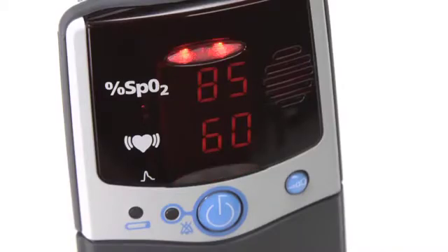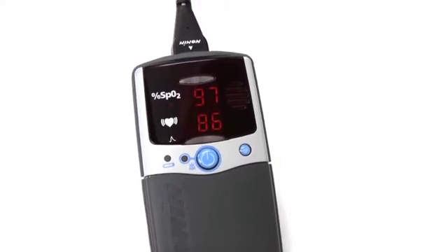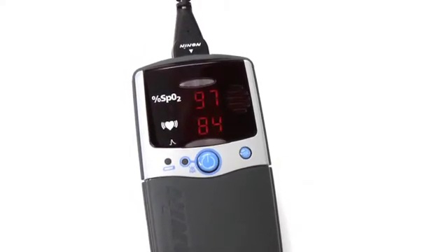The 2500 and 2500A models are identical, except the additional ability of the 2500A model to program alarms that indicate when oxygen saturation or pulse rate fall outside of preset ranges.